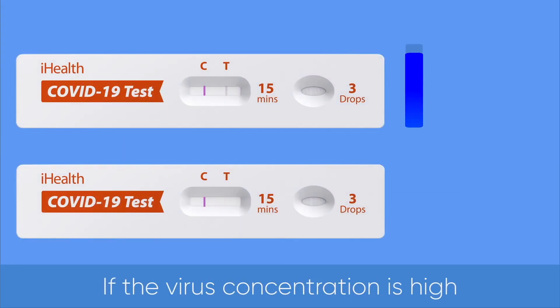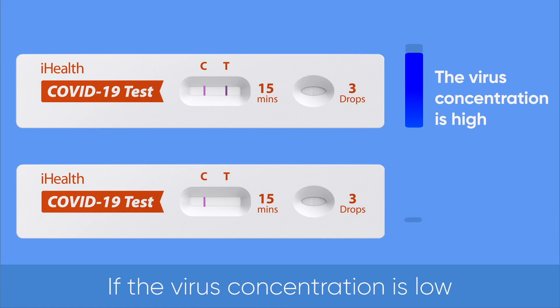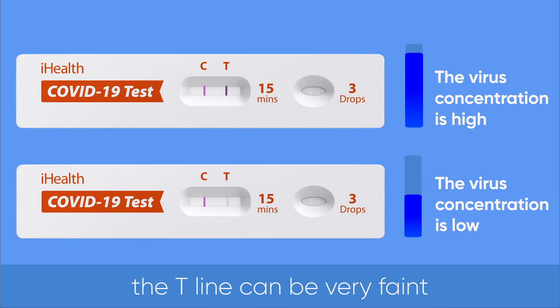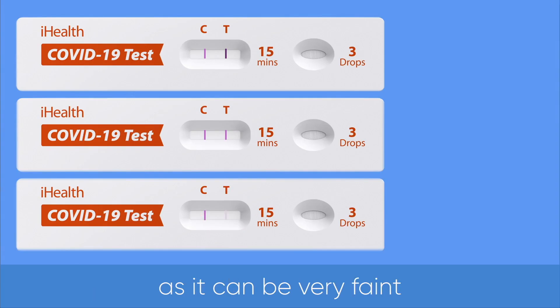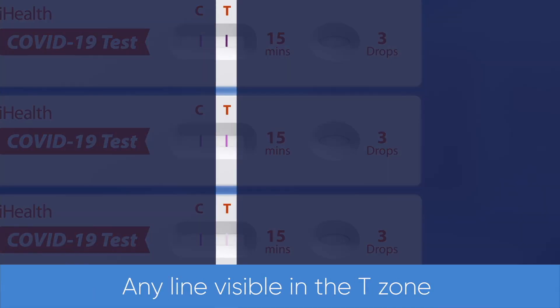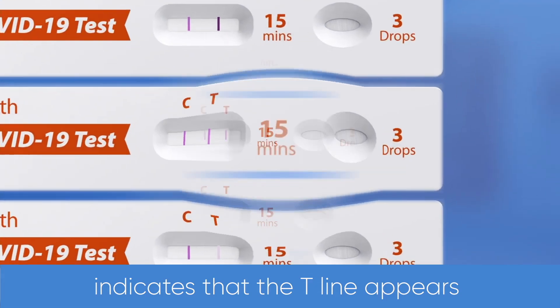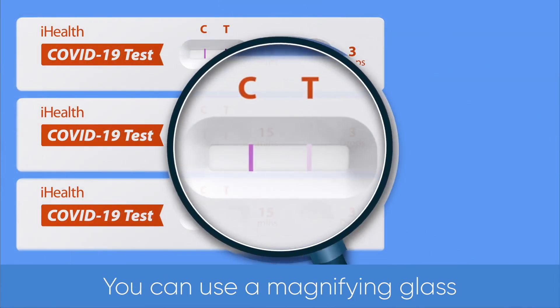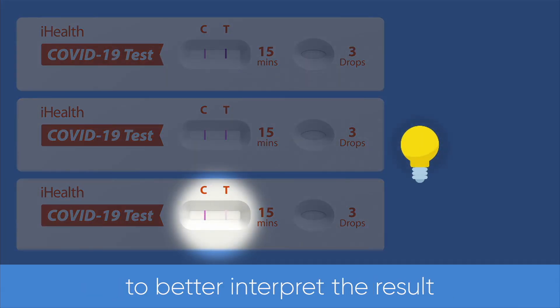If the virus concentration is high, the T-line will be dark. If the virus concentration is low, the T-line can be very faint. Note: please make sure you look for the T-line very carefully, as it can be very faint. Any line visible in the T-zone indicates that the T-line appears. You can use a magnifying glass or place the test card in direct light to better interpret the result.